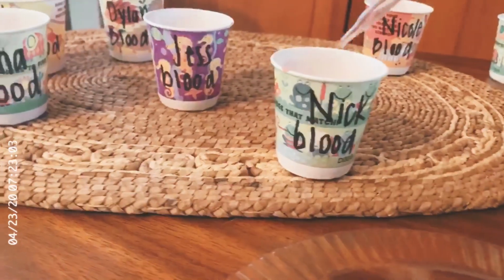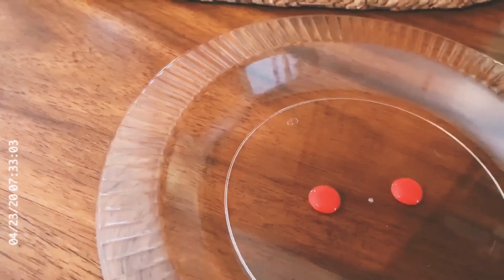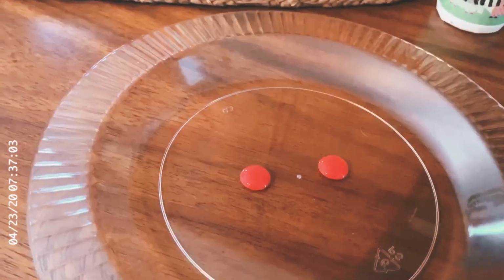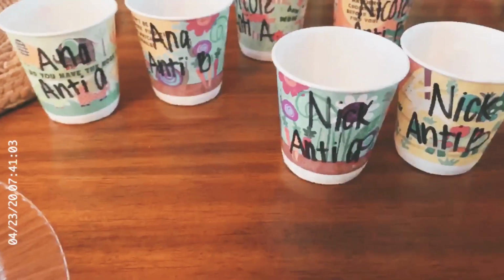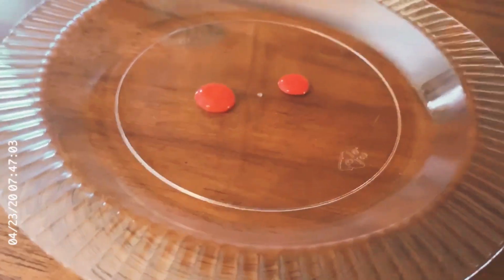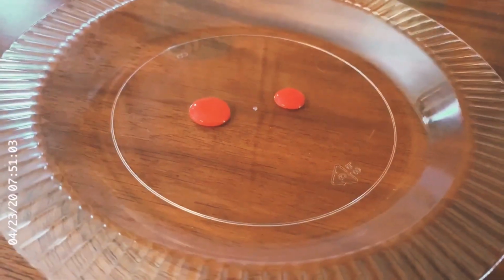All right, let's do Nick next. We're gonna get a blood sample from Nick, 2 drops on our plate. Clear out the dropper. We're low on supplies because I'm not at school, so we're only using 1 dropper, so we gotta clean it out really good in between so we don't get any cross-contamination. Nick anti-A. And then I'm gonna go ahead and do Nick anti-B.